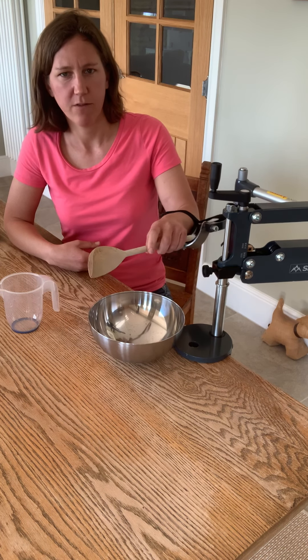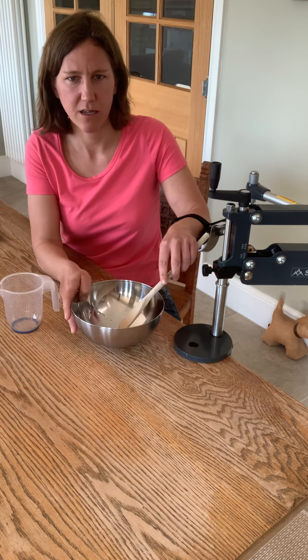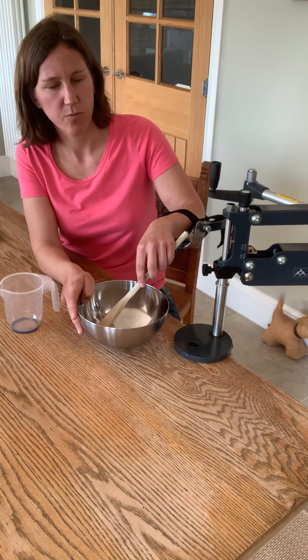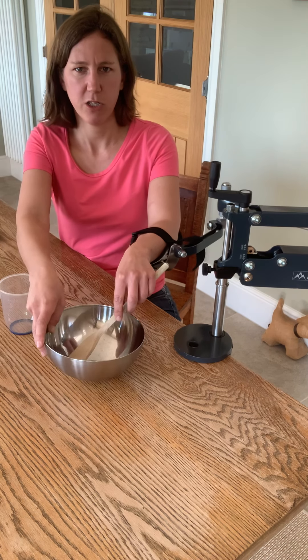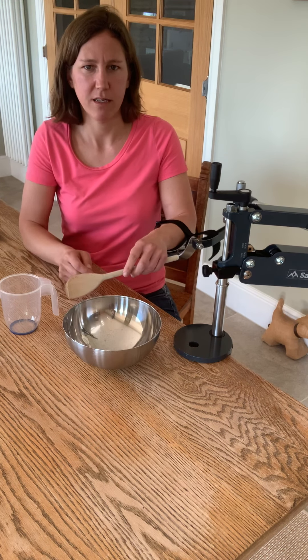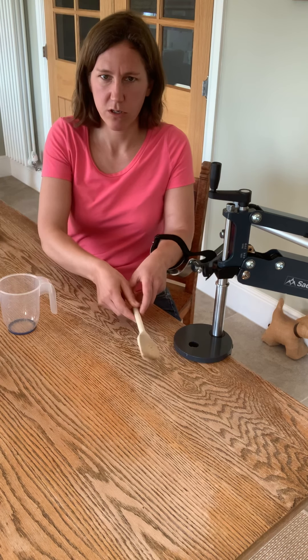This time I've got a smaller object to grasp, so it's going to be a little bit harder and more challenging. You can then start to bring in both hands and actually use two hands at the same time, which is what we do for most tasks — a bit more normal. You can practice mixing one way and then the other. To make it more challenging, you can have the object further away; to make it easier, a little bit closer. There are lots of different things you could practice — go with what's interesting and relevant to you in your kitchen.